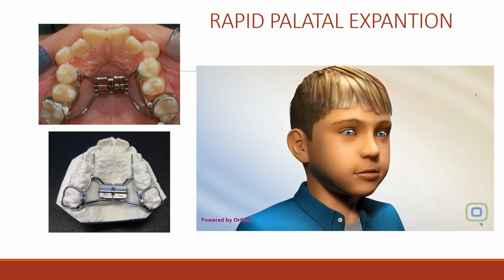This generally equates to the maxillary palatal cusp occluding on the lingual inclines of the mandibular molar buccal cusps. And expansion here is mostly skeletal before the age of 16, when there is a patency of the mid-palatal suture. Following expansion, the appliance is left in place for approximately 3 months as a retainer.